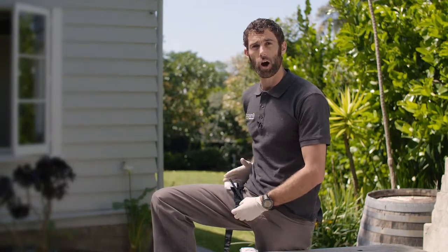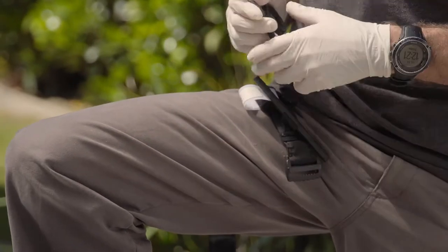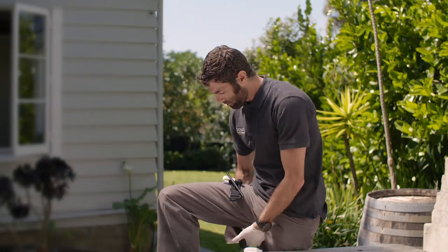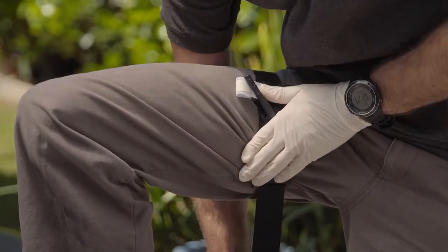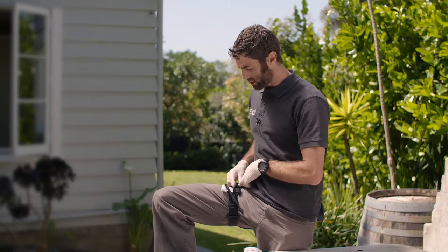When you put it on, try and remove any clothing — cut the pants up so that you can put it directly onto skin. This prevents the clothes from moving and loosening the tourniquet when you're moving the patient. Wrap it right around through the buckle and pull it nice and tight before you Velcro it. Use as much Velcro as you can so it doesn't slip.